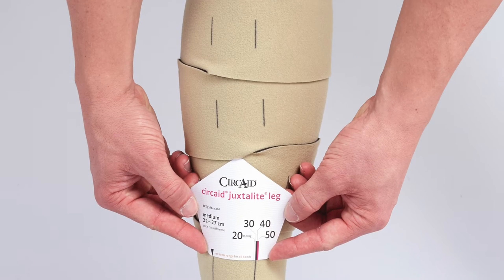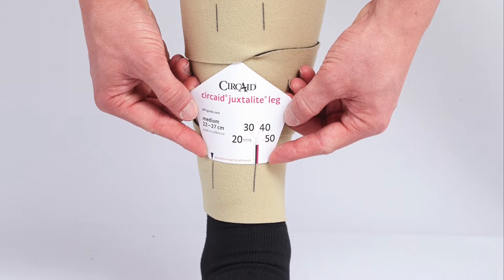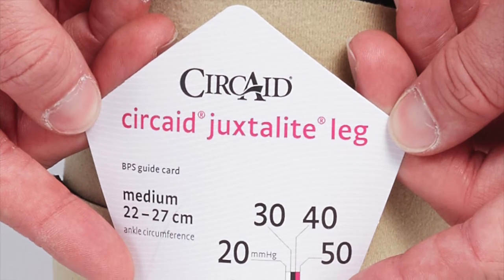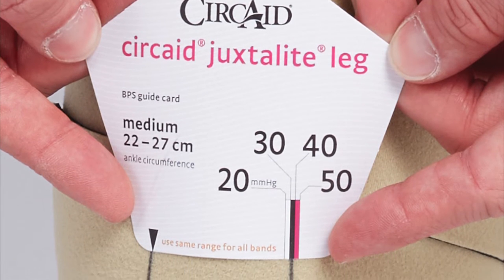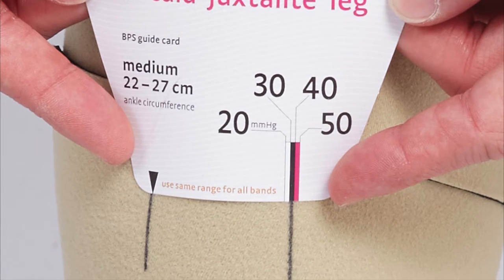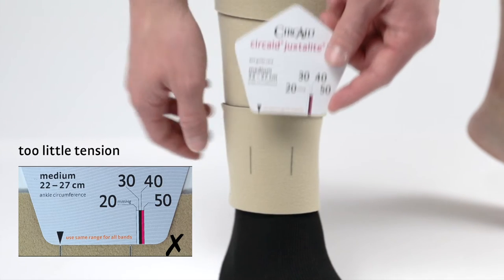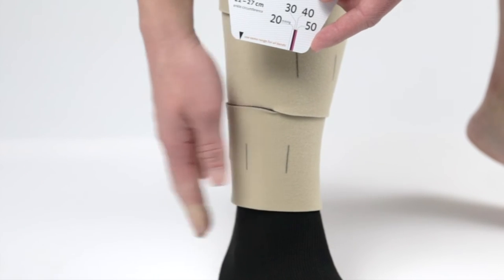To adjust the garment to your indicated compression level, take the BPS card and line up the vertical line on the card with one of the BPS lines on the bottom band. Note where the second BPS line lines up with the card's compression ranges. In this case, the patient needs 20-30 mmHg. If more compression is needed, tighten the band until the correct compression range is achieved.